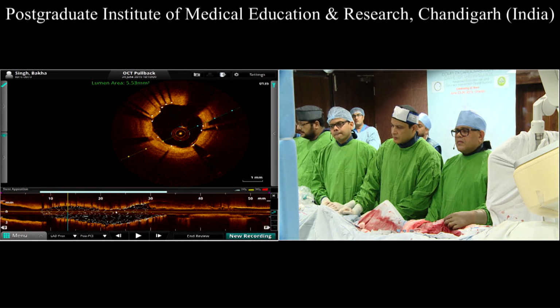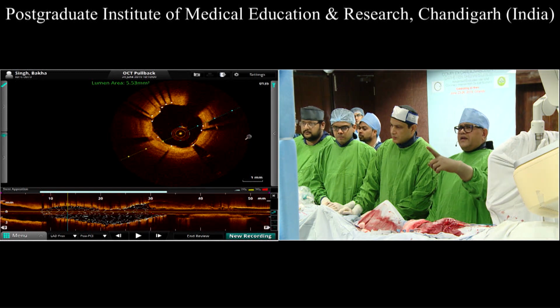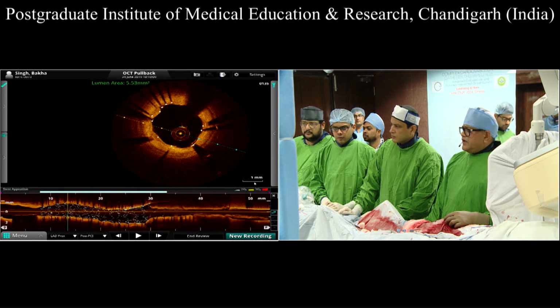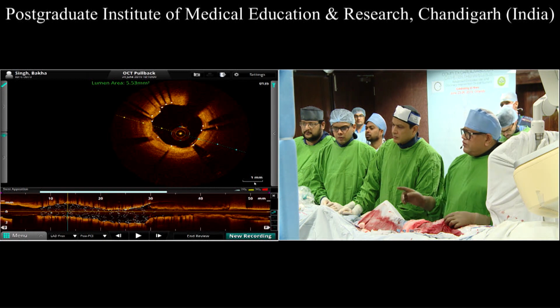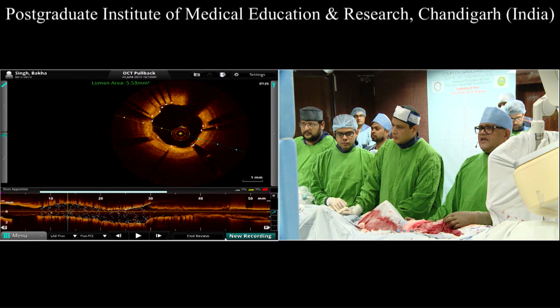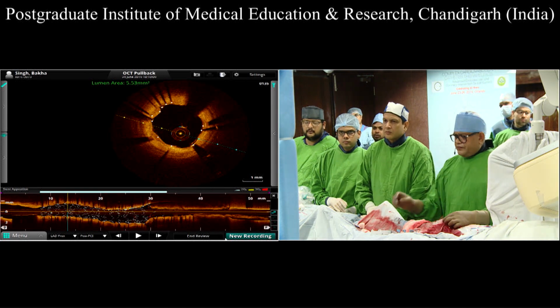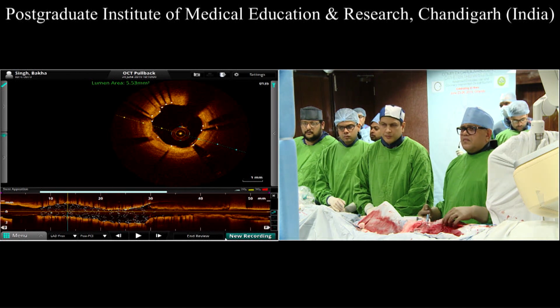Decided, Dr. A, what would you do now? I think the LAD stent is well apposed with a 3.5 size, and we have already done the POT, though there is some blood across the left main. We couldn't optimize the left main stent. The rest of the results seem to be satisfactory. Any comment about it? What do you feel? I agree that it is good.